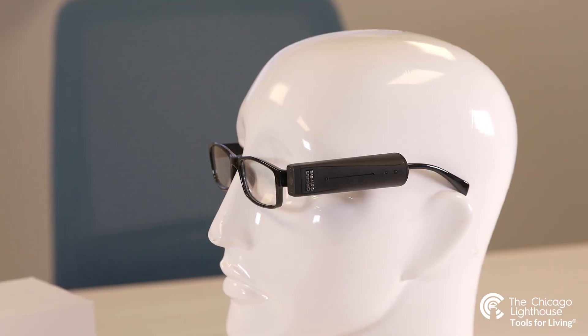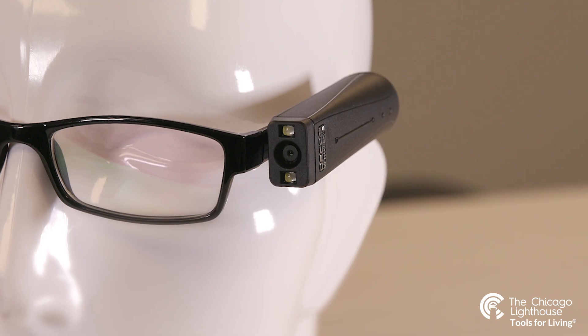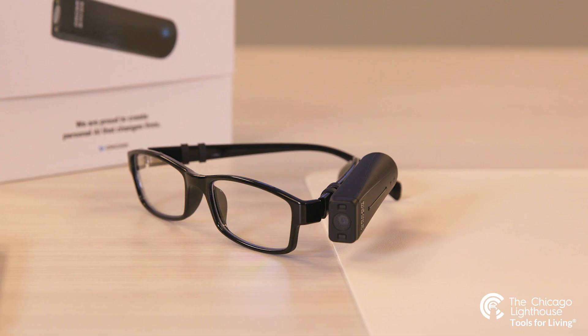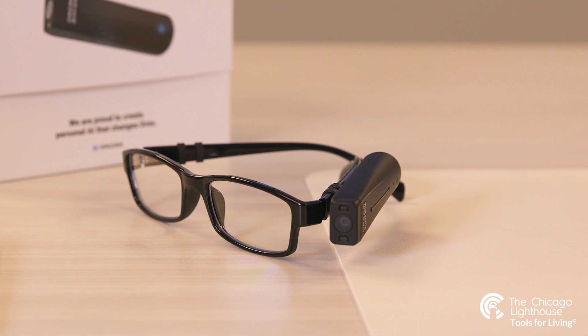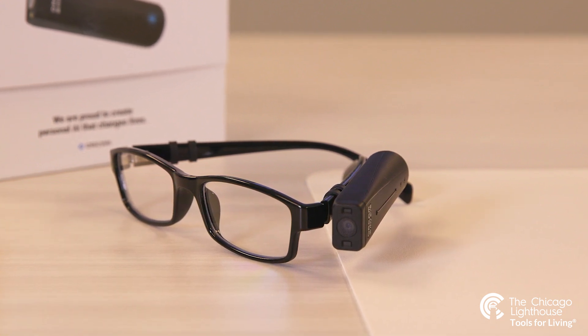The small portable device has a camera with optical character recognition technology and is designed to fit in the wearer's pocket. The system discreetly clips onto the wearer's glasses with a small magnet that can attach to any pair of glasses frames, excluding some wire frames if they are a little too thin.